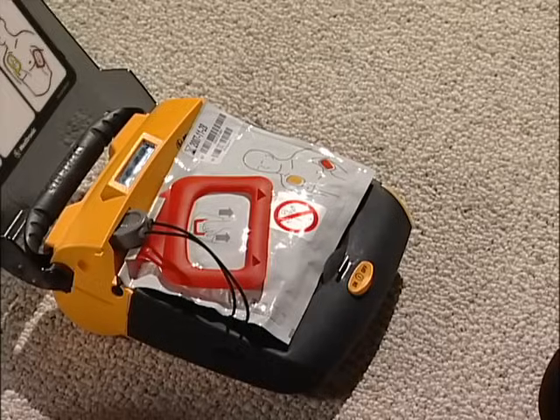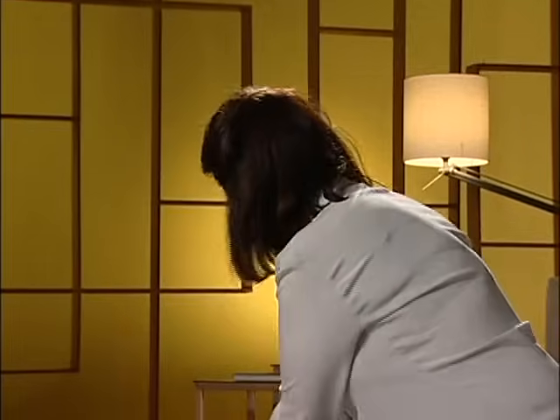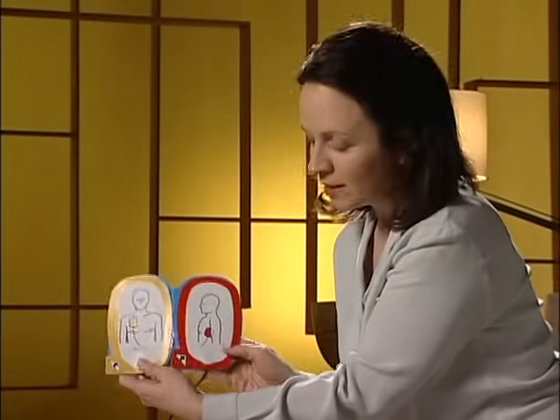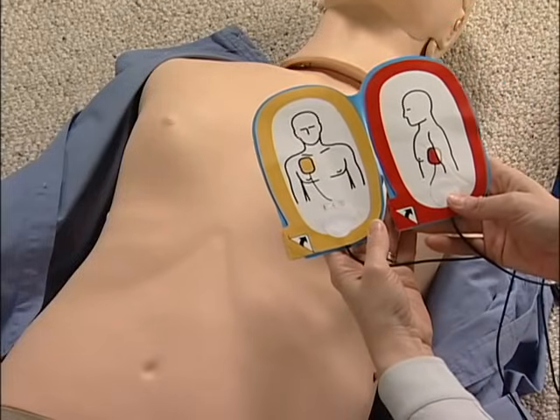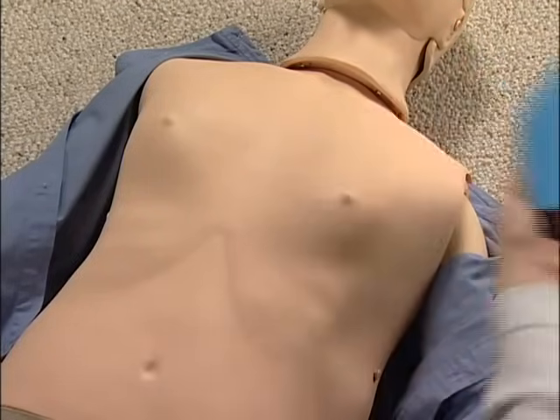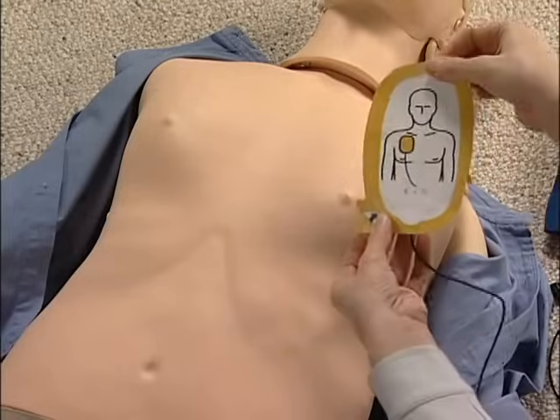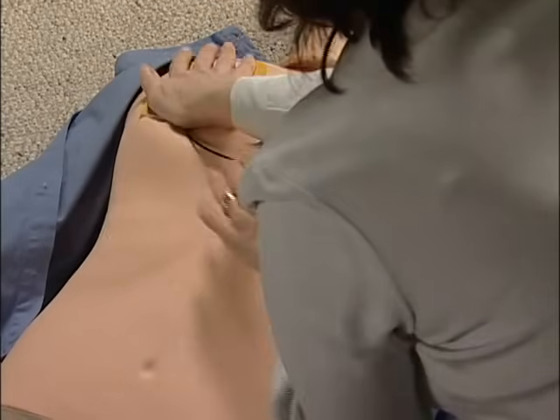Pull red handle to open bag. These are the electrode pads. Look at pictures on pads. Peel one pad off blue plastic. Apply pad to bare skin, exactly as shown in the picture. This pad goes here, just like in the picture.